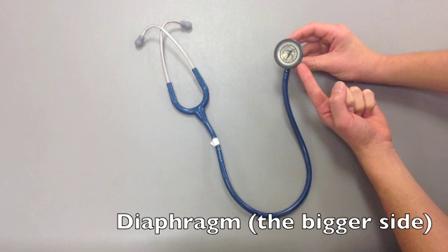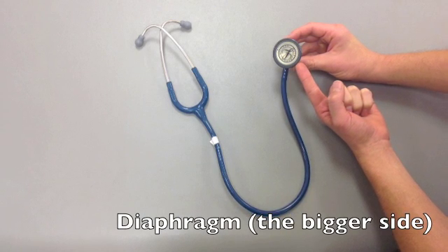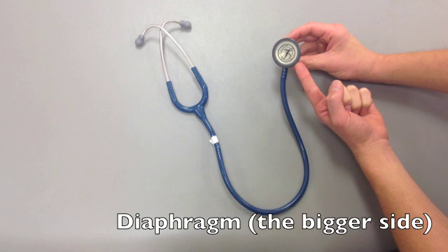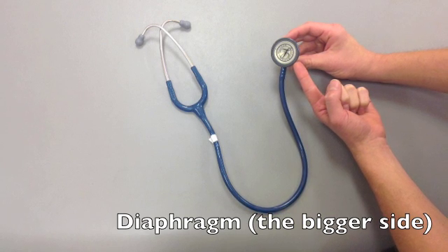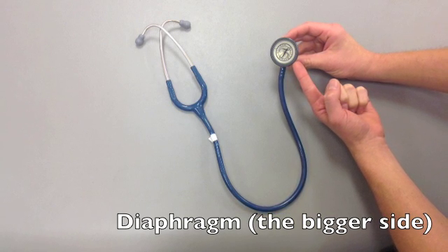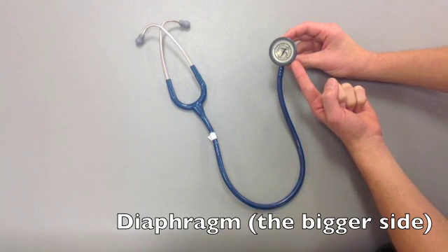For breath sounds, auscultation should be performed using the diaphragm of the stethoscope, which is the larger side indicated in the picture shown. Firm pressure should be applied when using the diaphragm.